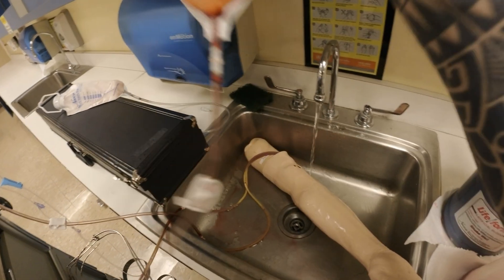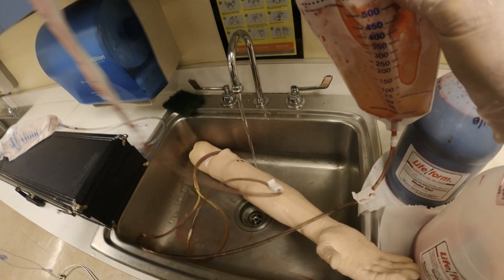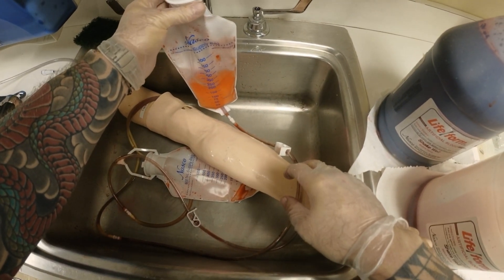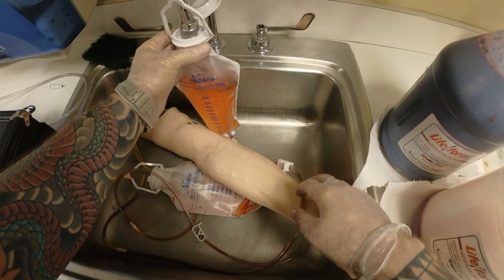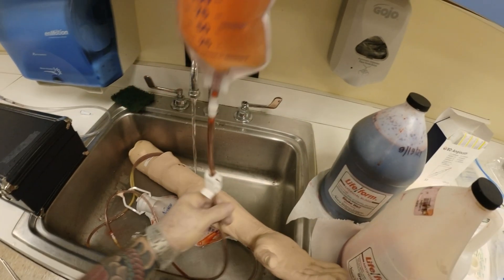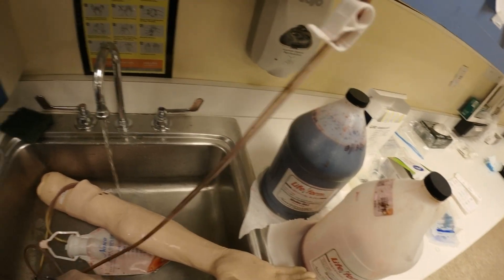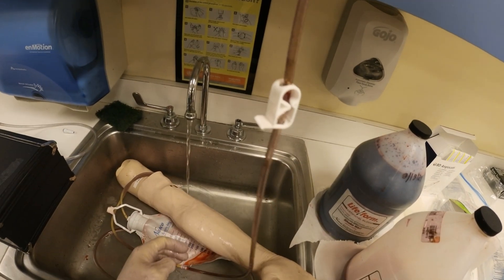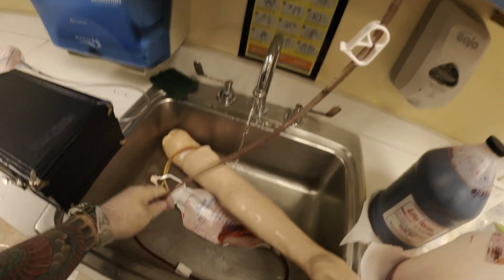I'll take this bag, put it down into the sink, open it up and run the water. Once I fill this up with some warm water I'm going to lift it up and make sure this water runs through the system. Once it runs through the system you will see it start to fill up in my other bag.